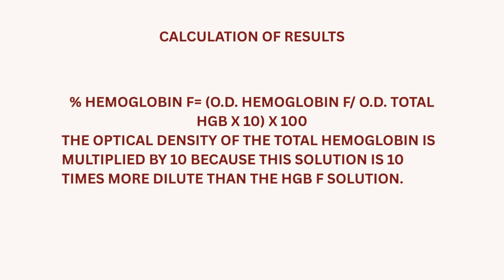So transfer the filtrates and total hemoglobin solutions to cuvettes and read in a spectrophotometer at a wavelength of 540 nanometers using cyan methemoglobin reagent to set the instrument at zero optical density. Record the absorbance of all specimens. So the optical density readings should fall within a range of 0.05 to 0.50 for maximum sensitivity. If the filtrate is too concentrated, dilute it using distilled water.